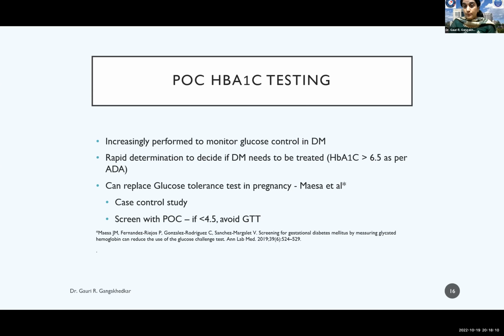Now, the biggest promise that these devices possibly show is that they can replace glucose tolerance tests in pregnancy. Now, Mesa et al. did a case control study where they found that when they did it with point of care testing, if it was less than 4.5, you can avoid a glucose tolerance test in all patients.